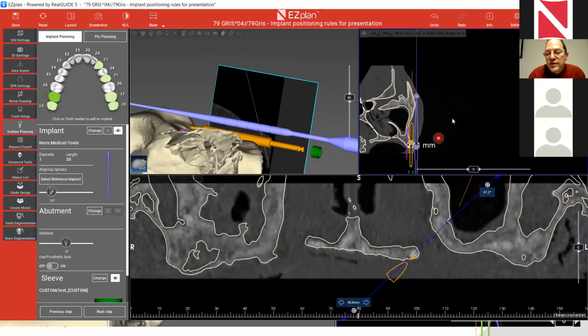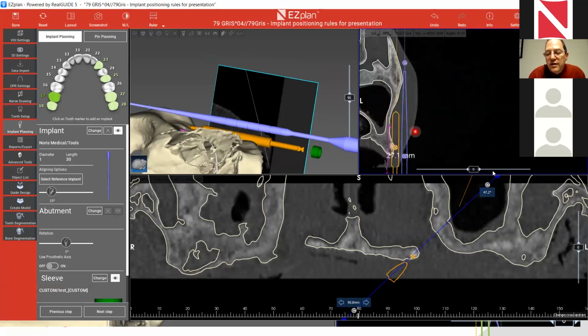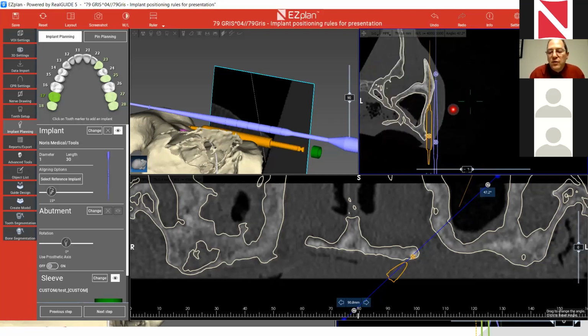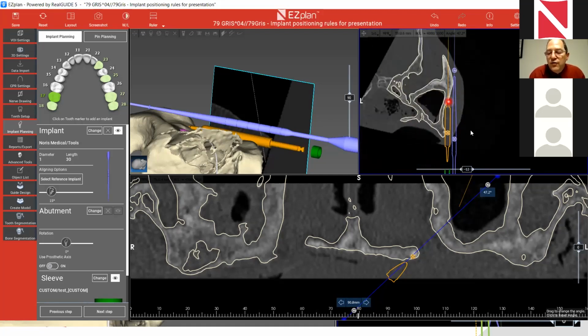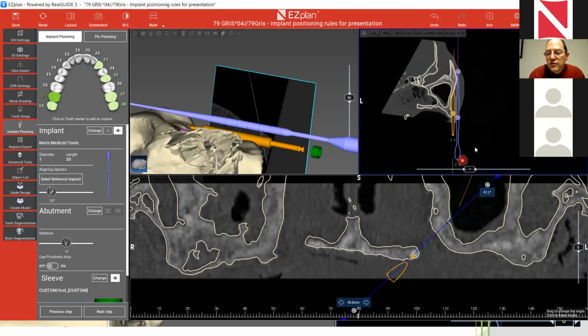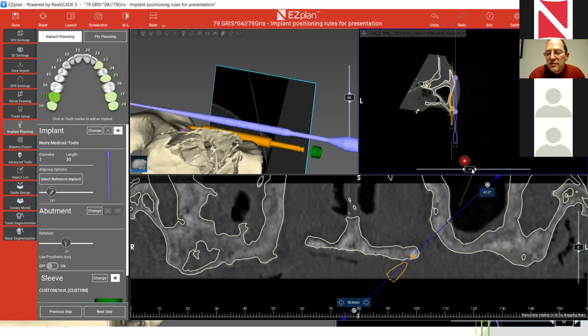And from what we see, this is a very short distance. So we know that actually, if we continue this way, the implant is going to be too much outside. That means two things. First of all, we didn't go down enough. For this entering point, we did not go down enough on the ridge. So we continue with moving down on the ridge like that.